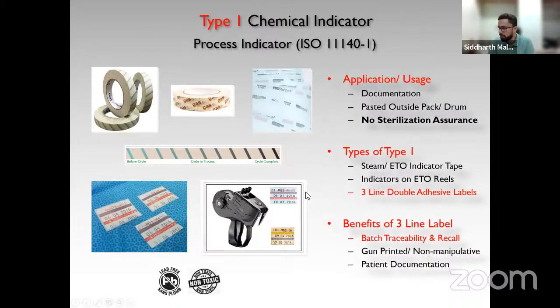So now you have a complete batch monitoring of each and every tray which is used on the patient. So for, say, after 3 or 6 months, if a patient comes to you saying there is some infection inside him for an implant case, and he is trying to put an onus on the hospital that it is because of your sterilization practices or infection controls, you always have a look back proof that you had sterilized this item in the CSSD on this date via this batch.